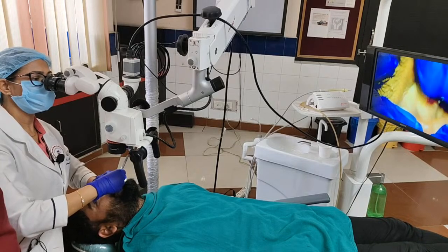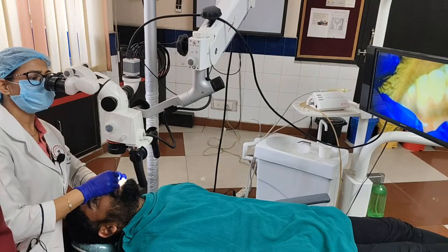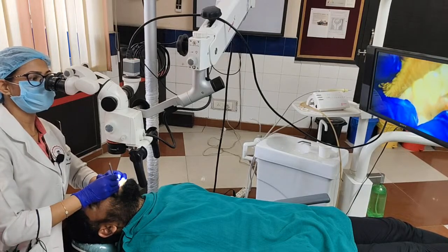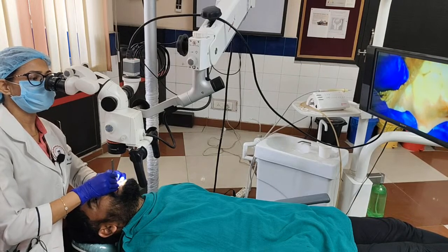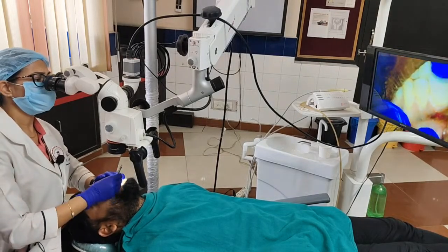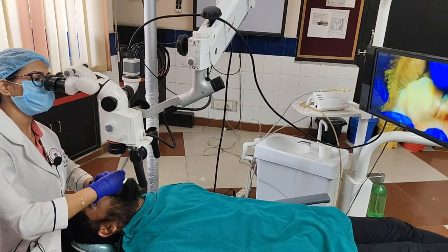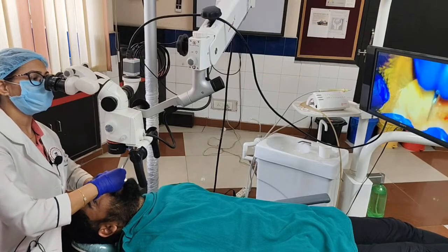And again, we have to be careful, because some of the most troublesome melanocytes are present at the tip of the interdental papilla. For example, you can see here also. But it is always advised not to touch the area because the tip of the papilla is very, very delicate, and we do not want to cause any kind of recession to the patient. Okay? So we are going to stay away from that. Two things you have to always stay away from: your marginal gingiva and the tip of the interdental papilla.